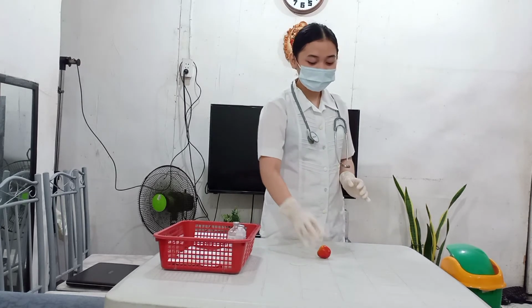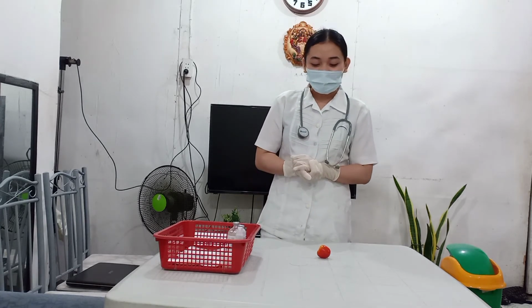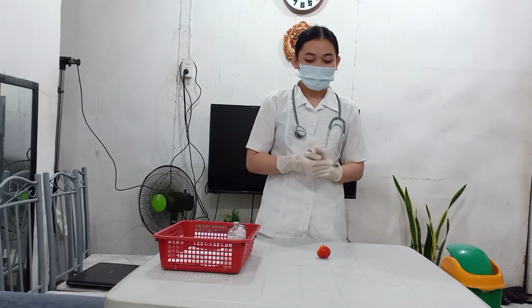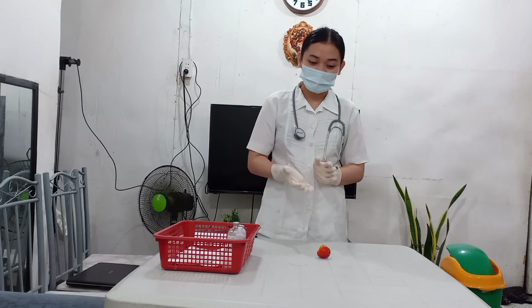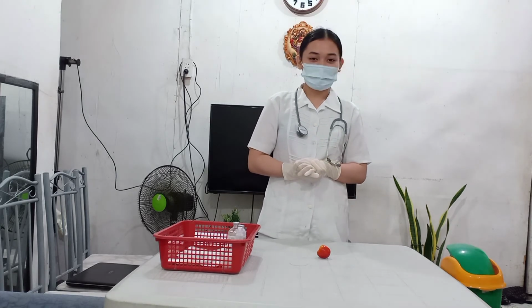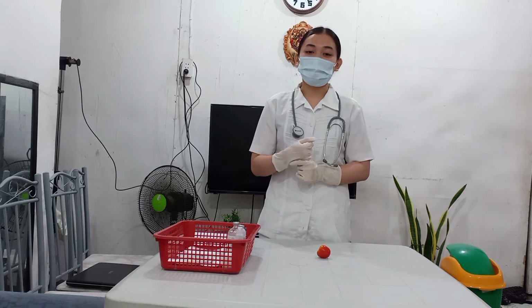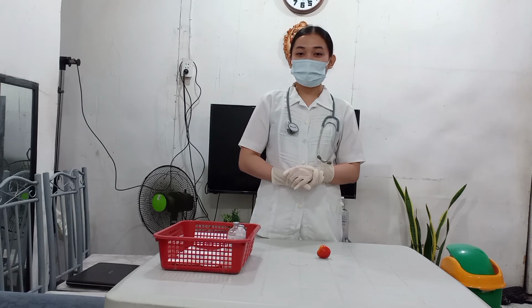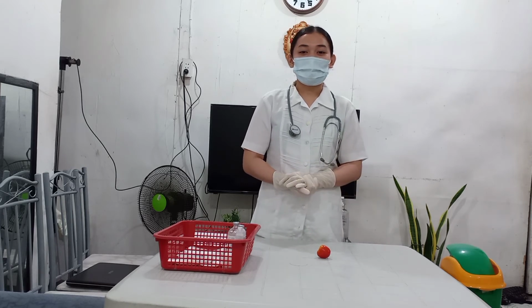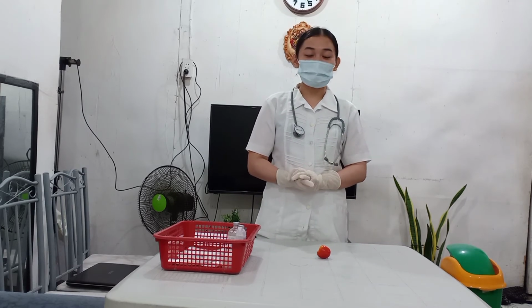So, I'm going to introduce myself to the patient. So, good day, Mr. Tomato. I am Priyan, your student nurse for today. And today, I will be administering a subcutaneous injection. So, next is to assist the client to a comfortable position. This is to provide clear visualization and easier contact when administering subcutaneous injection.